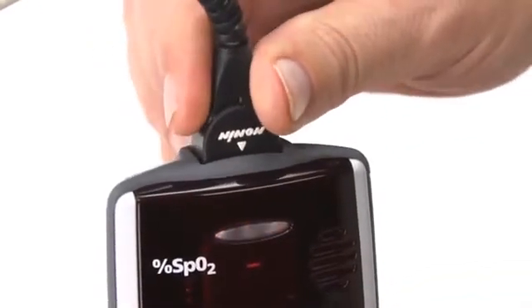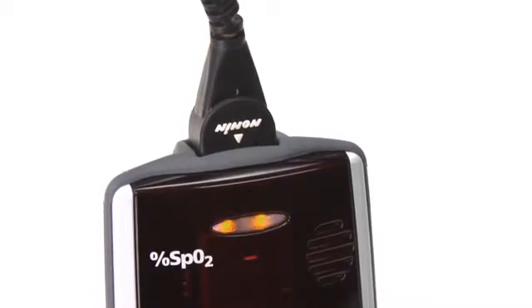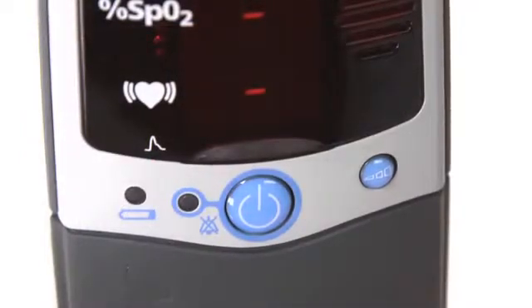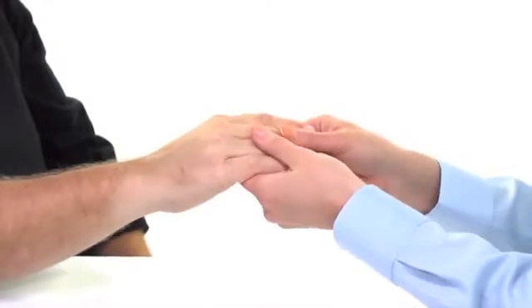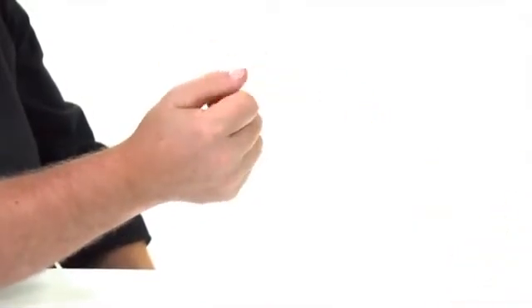Signal loss from the sensor is possible with hand or body movement or disconnection of the cable. Signal can also be reduced by body position or cold conditions, which may reduce blood flow. The audible alarm will sound a three-beep alarm every 25 seconds, and a dash will appear between the pulse and oxygen level displays. You can silence and restore the alarm with the press of the on-off button. Check and correct the position of the sensor if it has moved, and recheck the sensor connection to the oximeter. If the hand has been grasping a rail or is cold, relax and warm the hand to restore stronger blood flow.